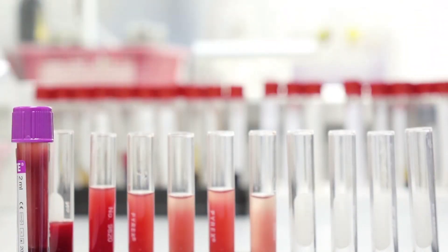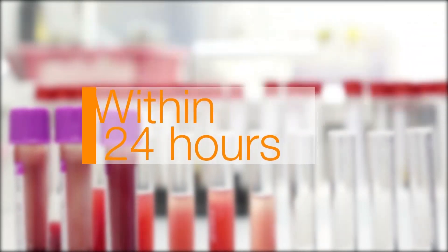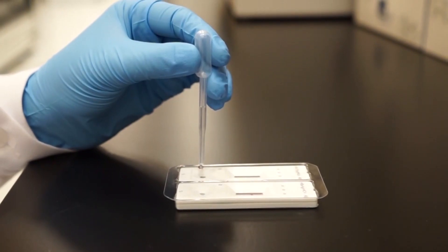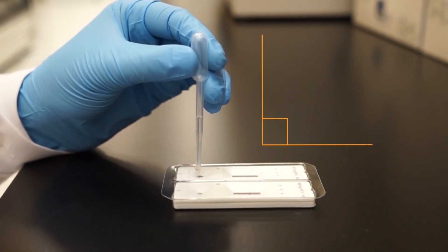Remember whole blood specimens must be tested within 24 hours of collection. For plasma or serum, store specimens at 2 to 8 degrees Celsius if not tested immediately for up to 5 days.